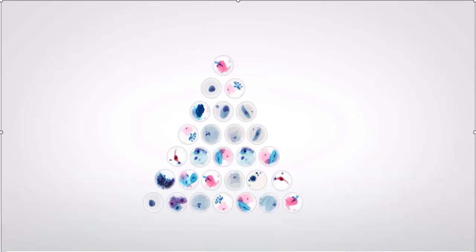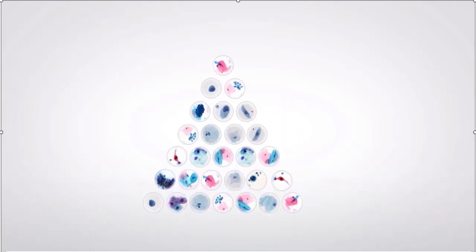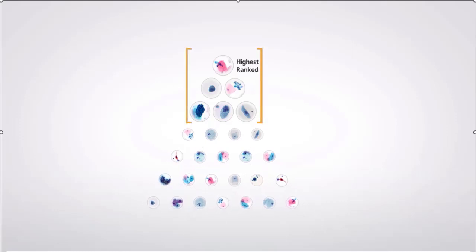Each slide is given a score that corresponds to the likelihood of abnormality. The slides are then grouped or batched into a unit called a print set. The slides within each print set are statistically ranked based on their individual slide scores.